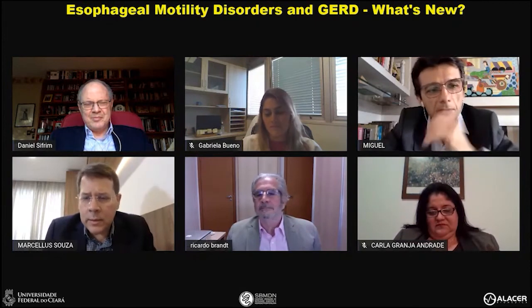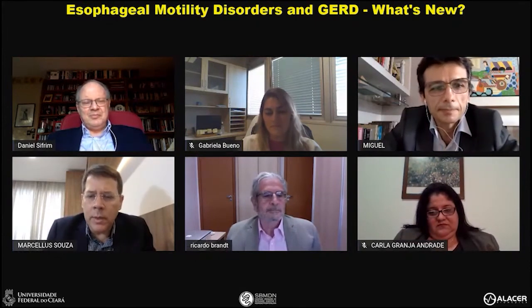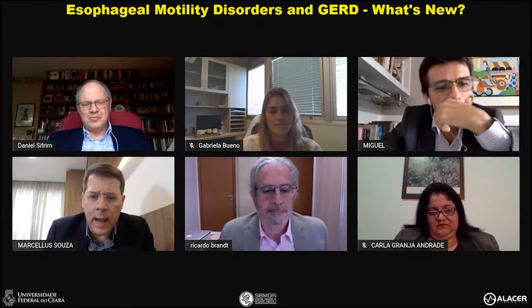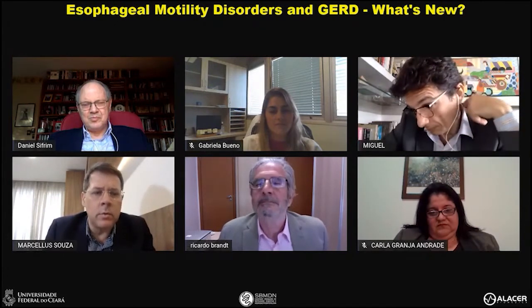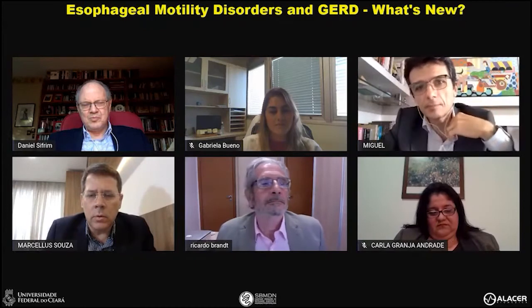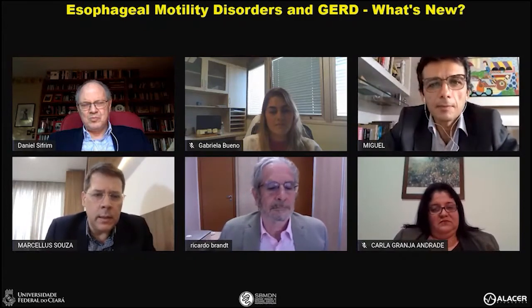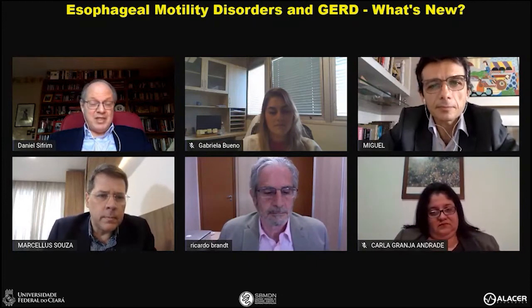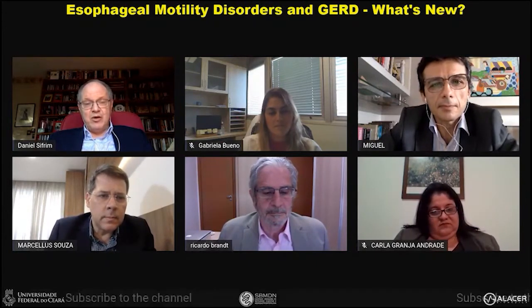One question is, what is your opinion about the duration of the pH monitoring? Is 24 hours the best time, or do we need more time to know what is happening in the esophageal disorders? I must say that the ideal scenario would be more time, and more time you can have with wireless pH metry.